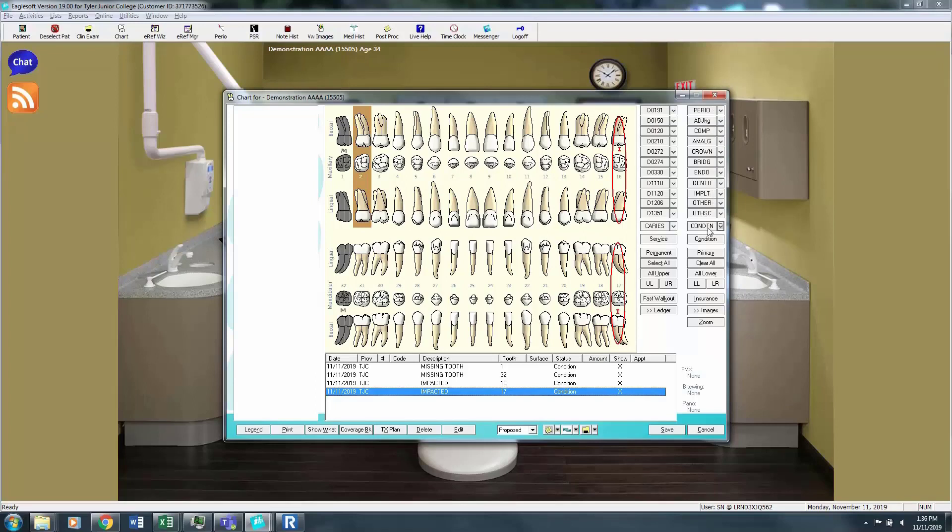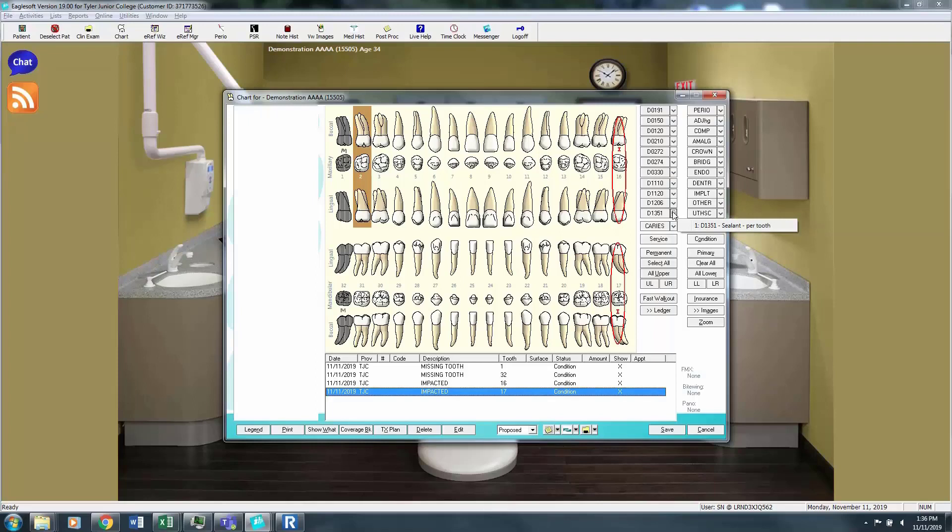Now we're going to work our way through the tabs and I'm going to throw some examples on some of these teeth. I'm going to say that tooth number 2 has an existing sealant. Now because sealants are proposed and completed by hygiene and that's a code that you need to be very familiar with, we do have that alongside of our hygiene codes because this will be treatment that will be proposed and completed in our clinic.